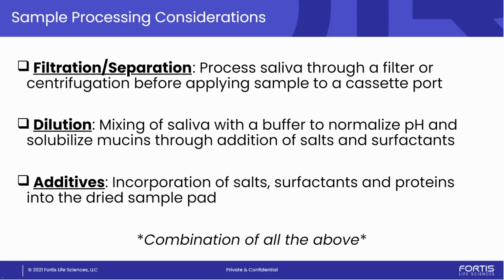Another solution to sample processing is dilution. One of the older solutions to this, and now there's a lot more on the filtration separation side. You don't always have to just jump to dilution, and the reason why I say that is because dilution adds complexity. Not that it's complicated, but for an end user, depending on your space, it can be.